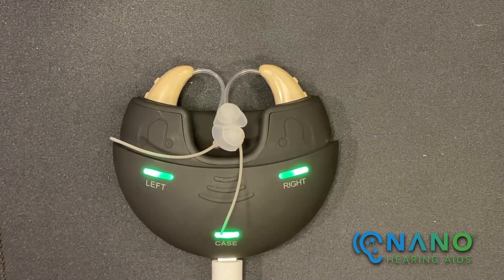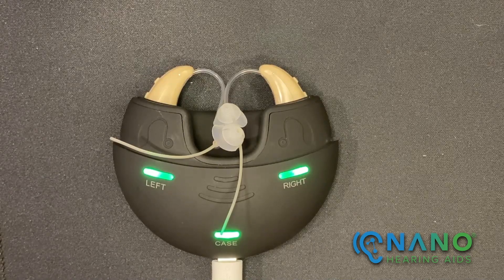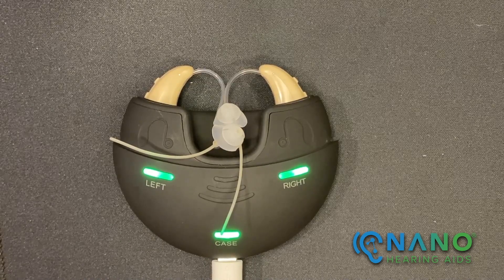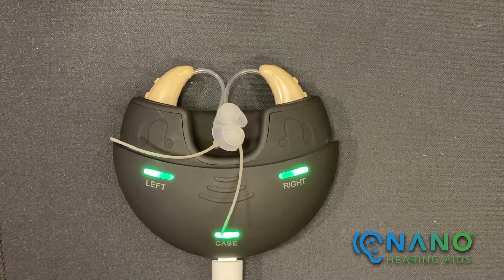If the hearing aids are charged for two and a half hours, the expected amount of hearing aid use time is 12 to 16 hours. A fully charged charging case can provide three charging cycles for a pair of BTE-4s.